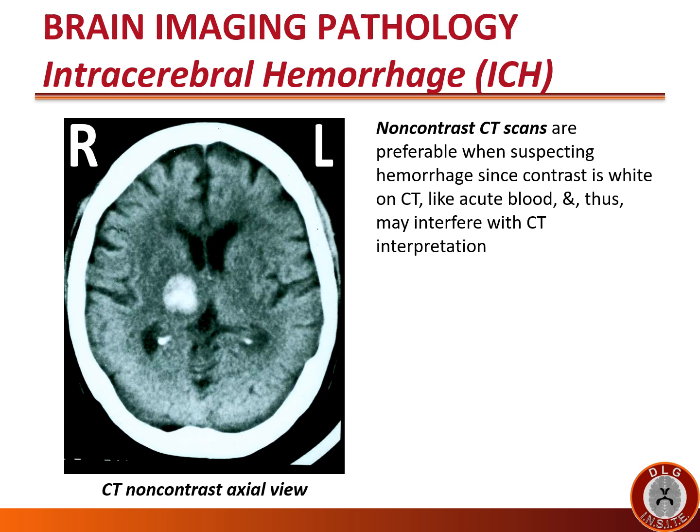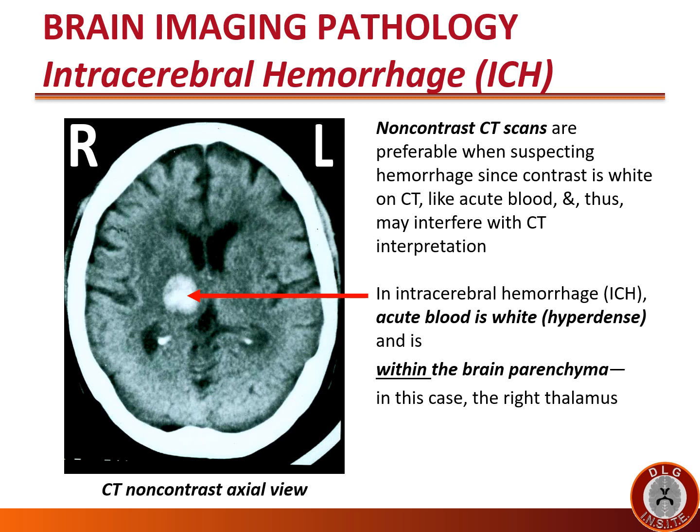Let's look more carefully at the imaging of intracerebral hemorrhage. Non-contrast CT scans are preferable when suspecting hemorrhage since contrast is white on CT, like acute blood, and may interfere with CT interpretation. In intracerebral hemorrhage (ICH), acute blood is white, hyperdense, and is within the brain parenchyma — in this case, the right thalamus — as seen in this CT non-contrast axial view.